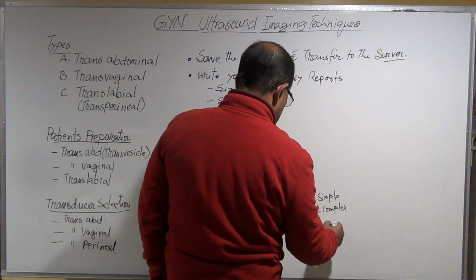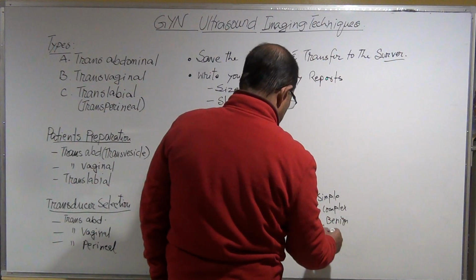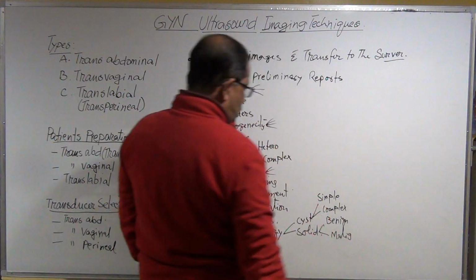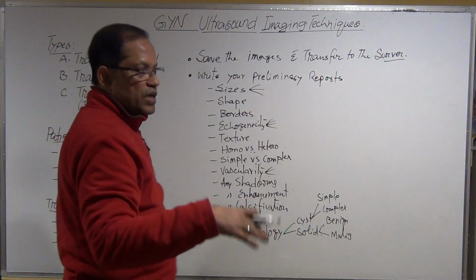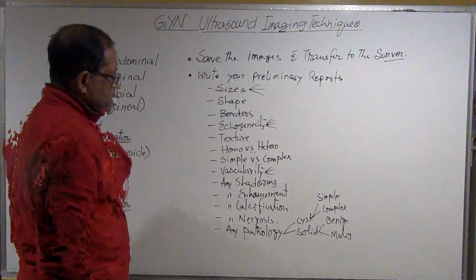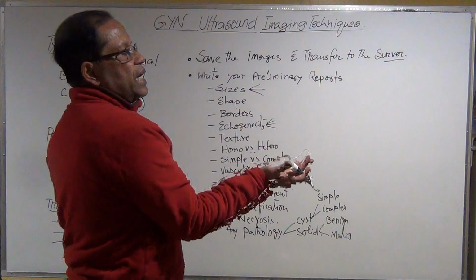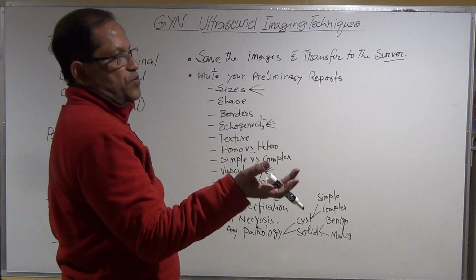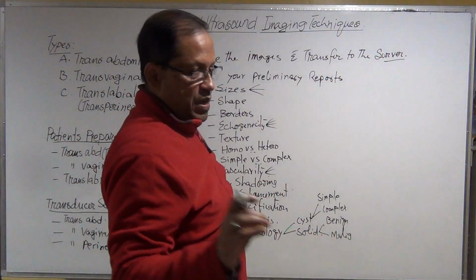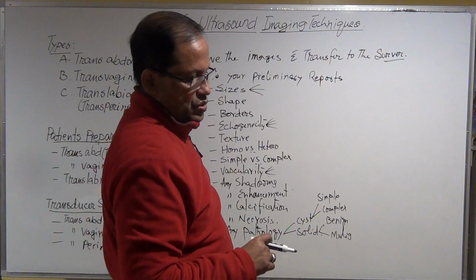And complex solid could be benign, malignant. Okay, and the rest of the things we're going to discuss during pathology. Okay, so those are the things you will express in your preliminary report, and you have to write your comment. But do not write the diagnosis.